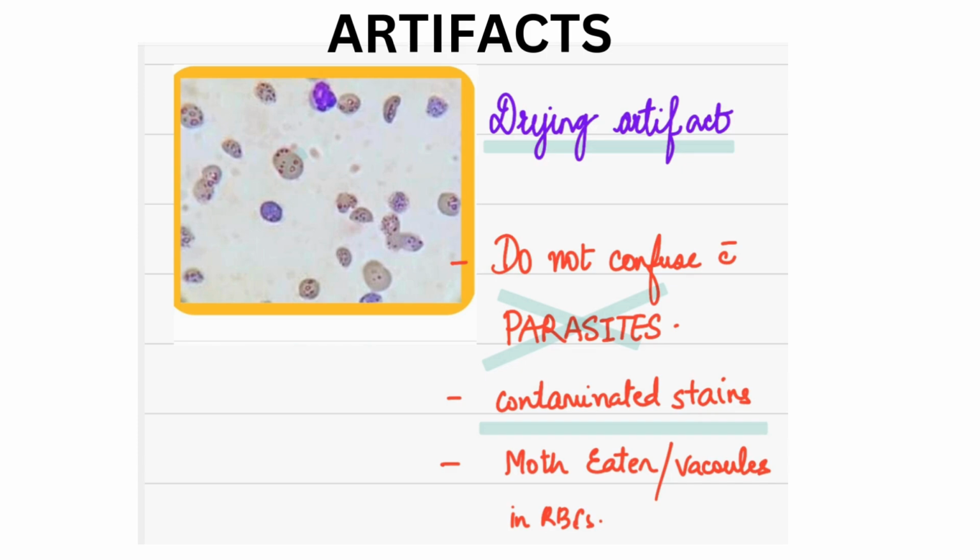And it's very important, because clinically when you are running a lab, or sitting in a lab, you should know what to do about it. So if you see this, you have to ask your staff or a helping colleague or anybody you're dealing with, that please change the batch of the stain we are using. Sometimes it is just about the stain and has nothing to do with the patient.